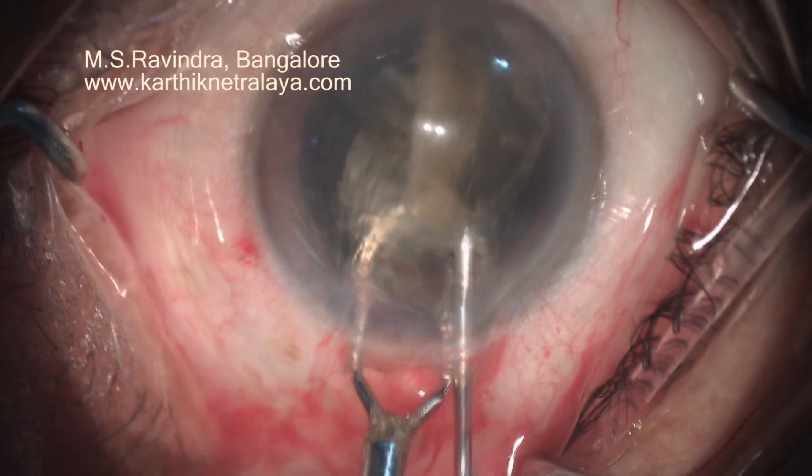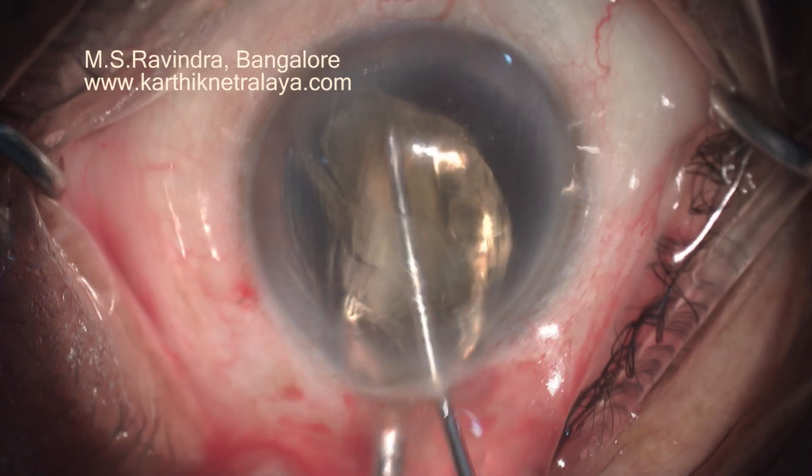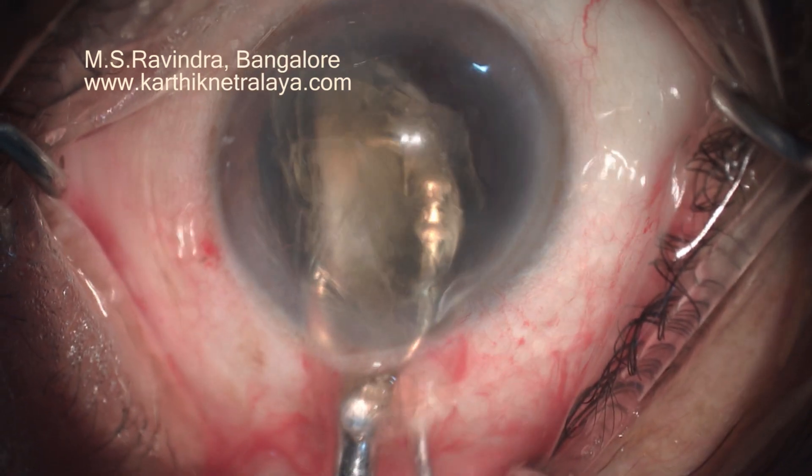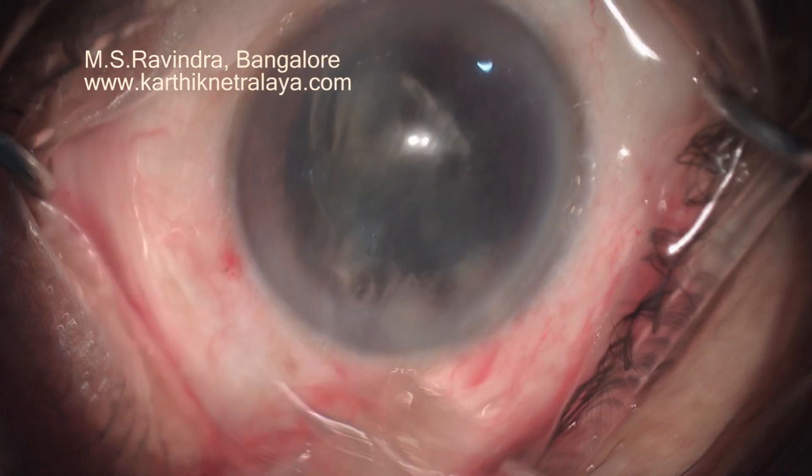One half of the nucleus is glided out, then the other half is glided out. Ensure that the tip of the nucleus does not go under the inner lip of the tunnel.